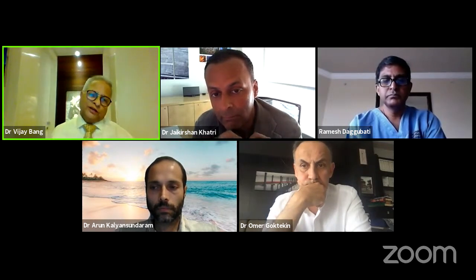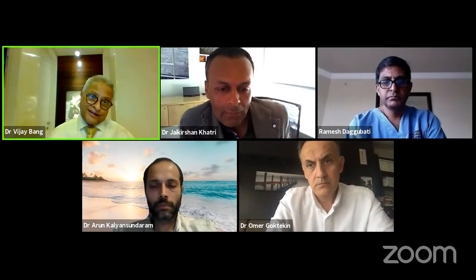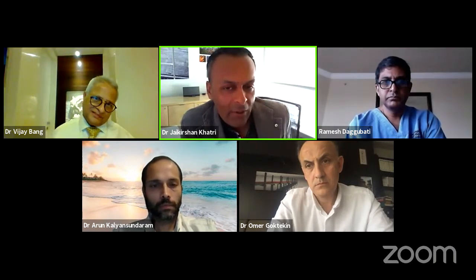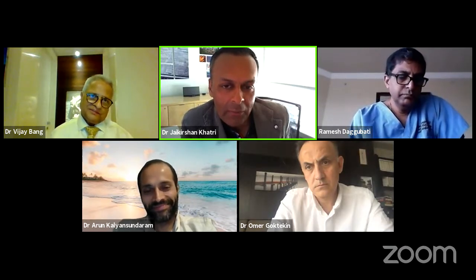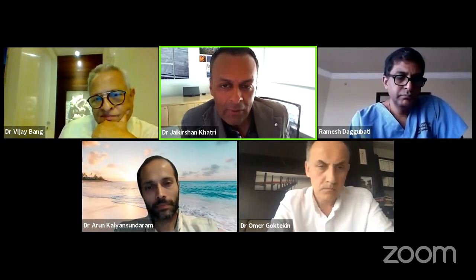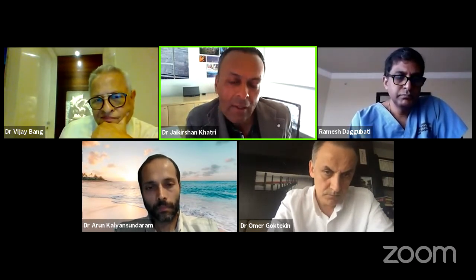Which patient do you think, can you guess, will be easier for reattempt? It also depends on what the options were and whether there are any criteria. I think that anybody who had a star, we should always bring back. Those are the most pleasant to bring back, because it almost always is just a nice antegrade procedure and the patient feels great. Patients who had an expert operator go through the entire algorithm and still failed, those are the ones you lose sleep over at night, thinking, oh my gosh, what am I going to do that this other operator didn't already try?